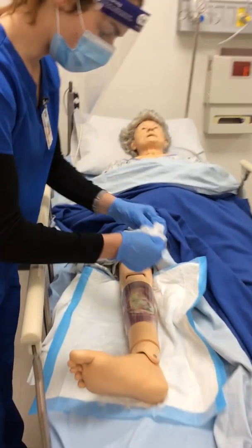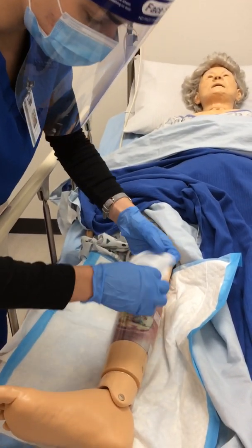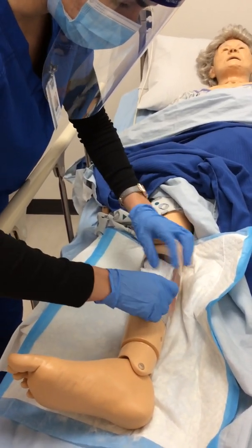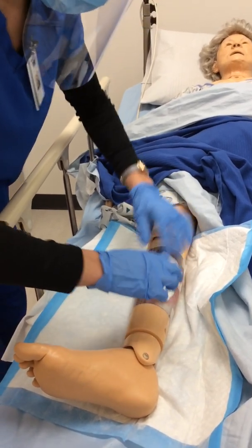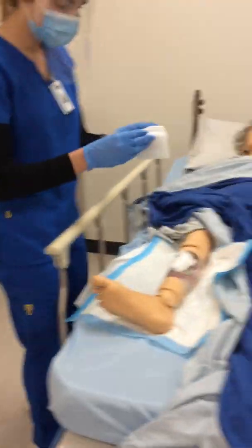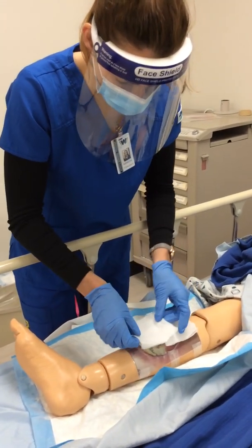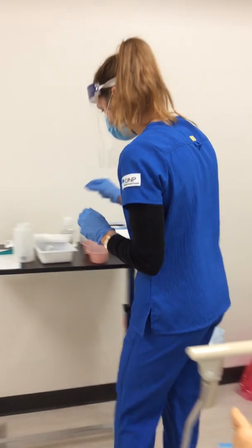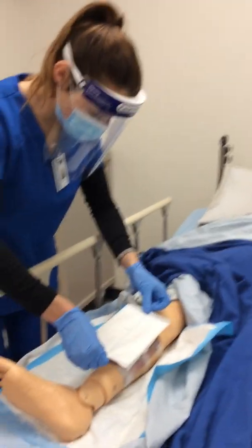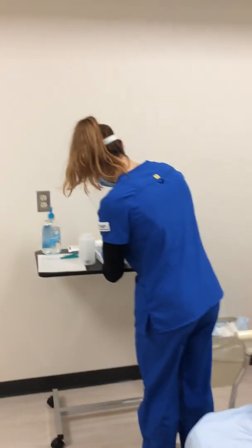Then we'll just want to place this on the damaged tissue, not the healthy tissue, because it can inhibit normal healing process. So we'll want to make sure it's only touching the damaged tissue. Okay. Then we're going to grab 2 clean gauzes that are dry, place them over top. How you doing, Shirley? Good, good. Okay. Then we're going to grab our abdominal pad and place it over the top. And it's the perfect size for your wound. And then we'll just get our tape.